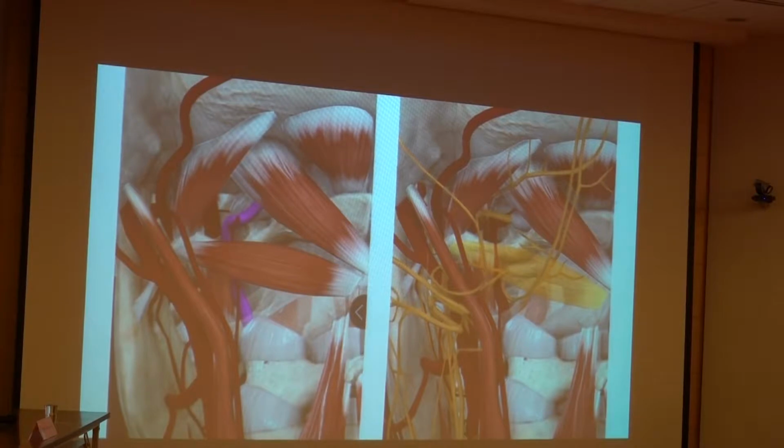Okay. And also one artery I want you to pay attention to is the vertebral artery, which, you know, the C1 transverse process is going to go through it. But when you look at the C1, you're not only seeing the vertebral artery before it becomes the circle of Willis. You're also seeing the ascending cervical artery, which is anastomosing with it. And you look at the occipital artery, wrapping around the longissimus capitis muscle over the insertion, you also see the deep cervical artery, which is really branching and then anastomosing with that. So those are the arteries you're going to look at when you're doing the ultrasound.